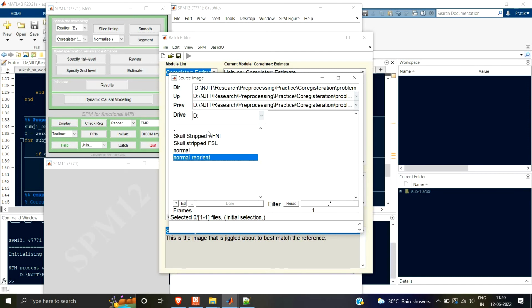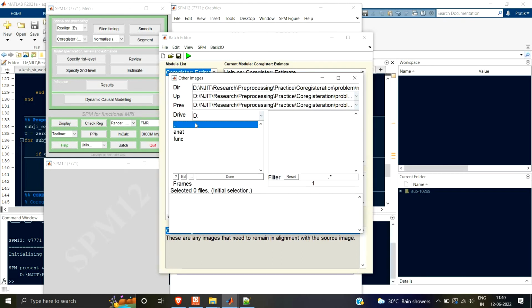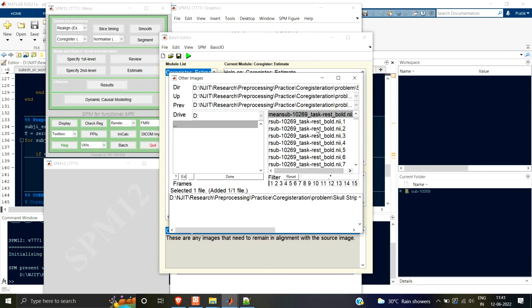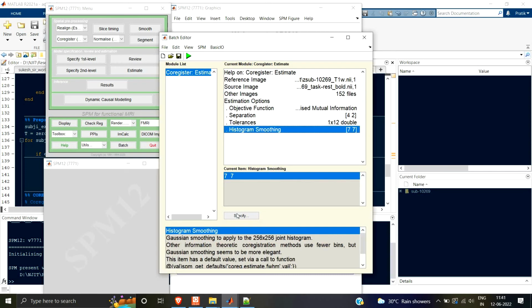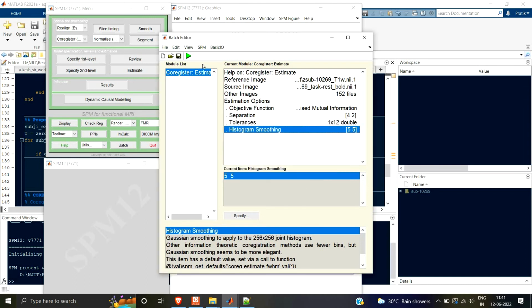Then in the source image, you will have to put the functional image. So either you can put the mean, and for other images, you can put this thing. Okay, press done. So I have 152 files over here. Maybe I can just change this to 5. If you don't know what I'm doing over here, I recommend you to see my co-registration video. I've explained in detail what all these steps are, and then press run.